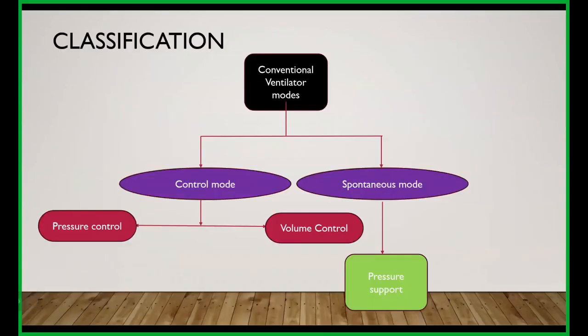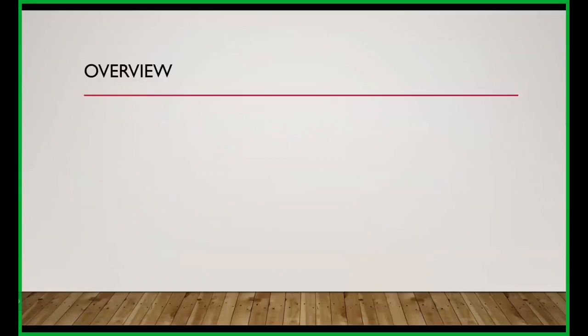Next, coming to the classification, your conventional modes can be further classified into control mode and spontaneous mode. Control mode, as you know, includes pressure control and volume control. In spontaneous mode, you have pressure support. Added to it, you have CPAP and also PEEP.